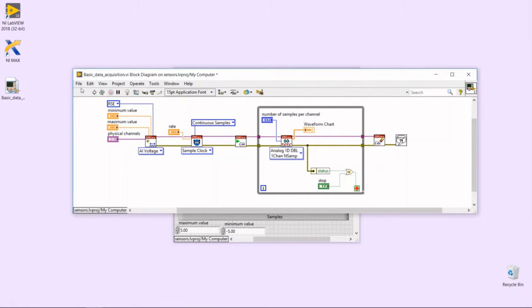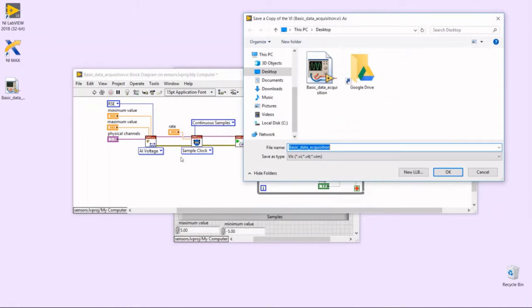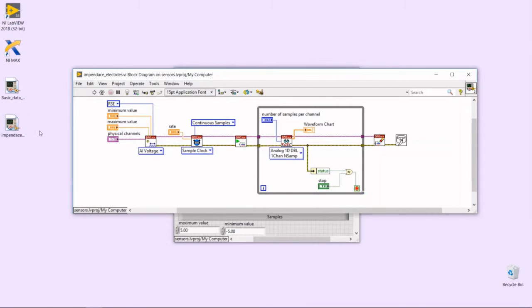Okay, so I'm going to save this with another name so we know that it is for electrode testing. Okay, so we have another copy of that program. Next thing to do is to program our application.